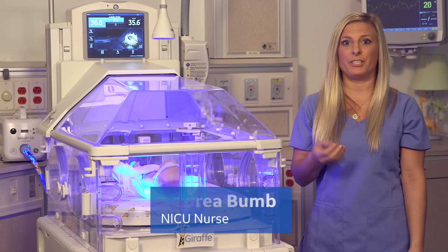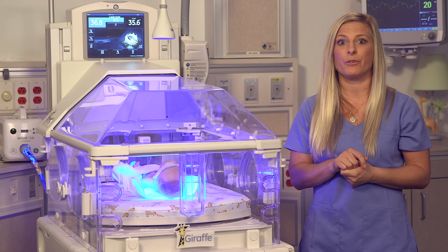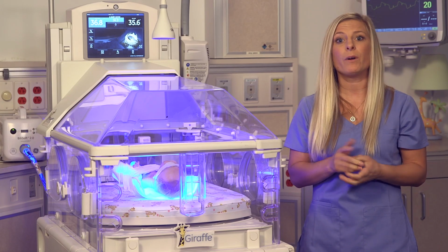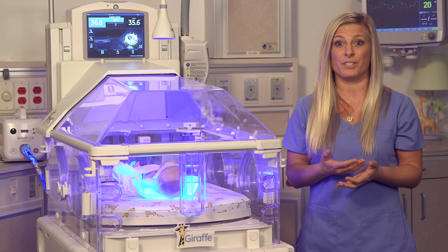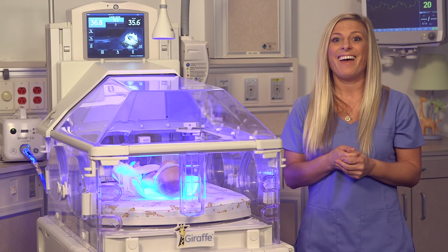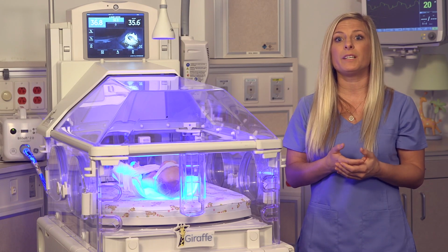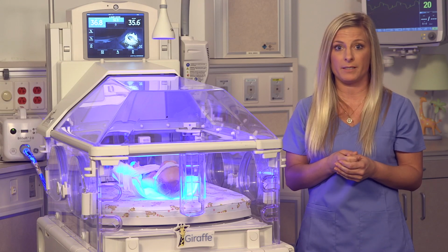Part of my job at GE is to work with customers around the country on how to understand and use our products to treat and help take care of their babies. We wanted to do this special series for you on phototherapy because we get a lot of questions on it. A lot. And there's so much misinformation and confusion on phototherapy that we wanted to bring this series of videos to help you use phototherapy to treat your babies.